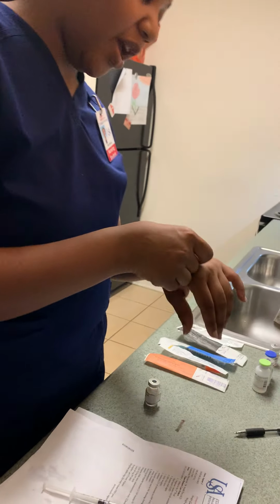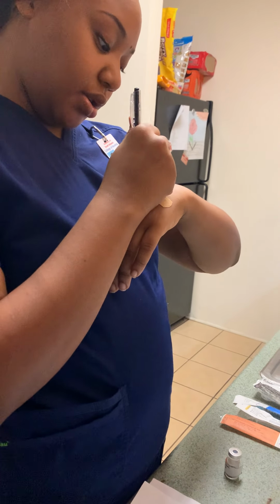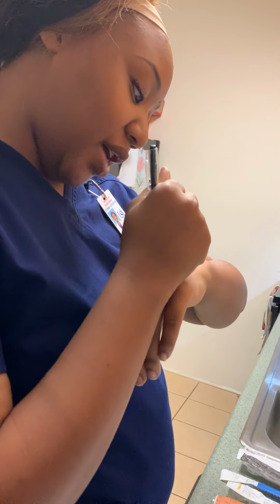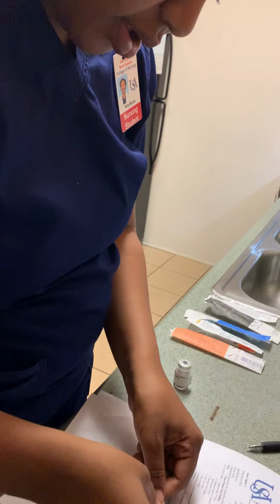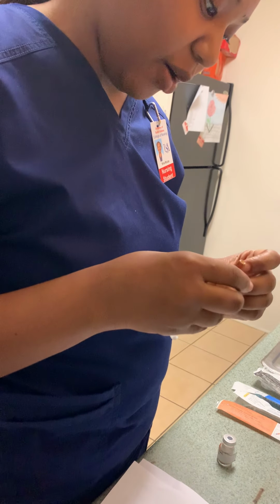Now I also do not have any tape today, so I'll be using a bandage to write the patient's name, the medication, as well as the dose. So I'll be writing Jaguar Jones, 0.5 milliliters, and heparin. And I will wrap it around my syringe, so I will know that this is what I'll be giving my patient.